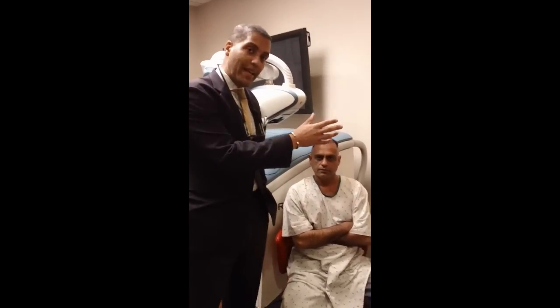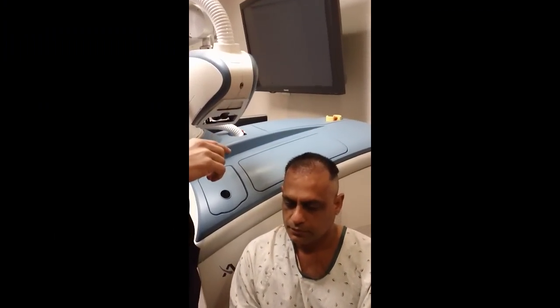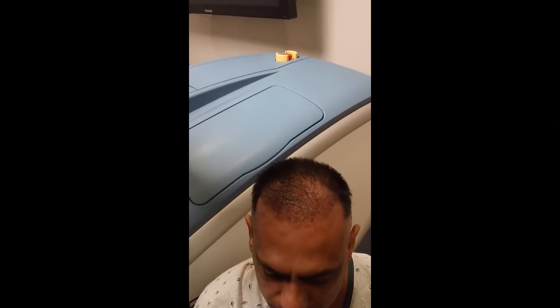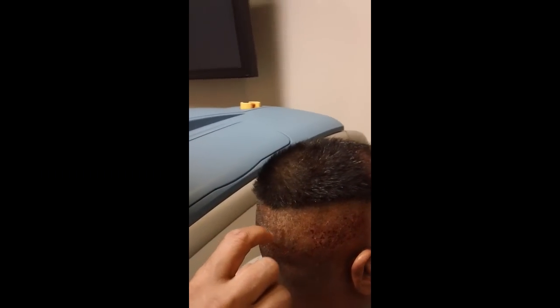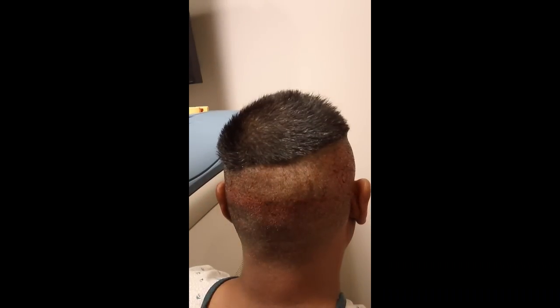He's a previous patient that had FUE and had 2,000 grafts throughout this area here about eight months ago. So we brought his hairline further and really didn't go in the area that we went in before. If you can turn around here, you can see we kind of just went on the sides here and did approximately almost 900 grafts from the ARTAS system.